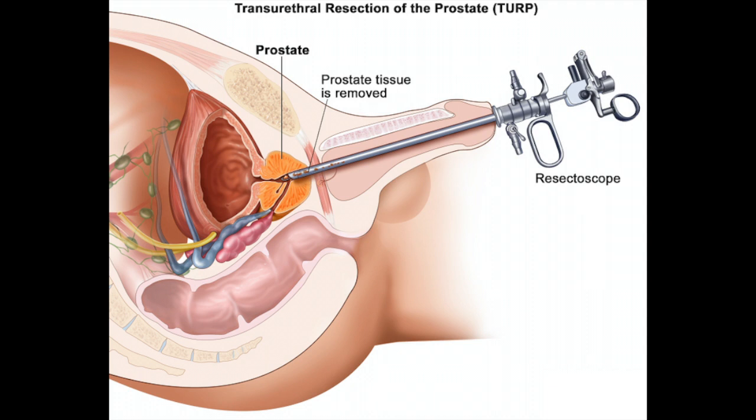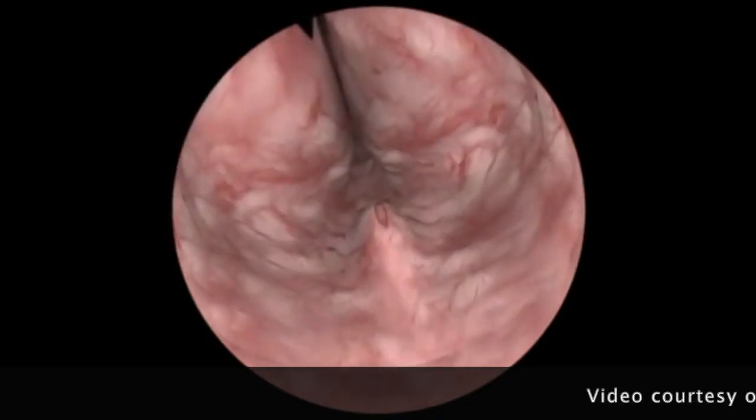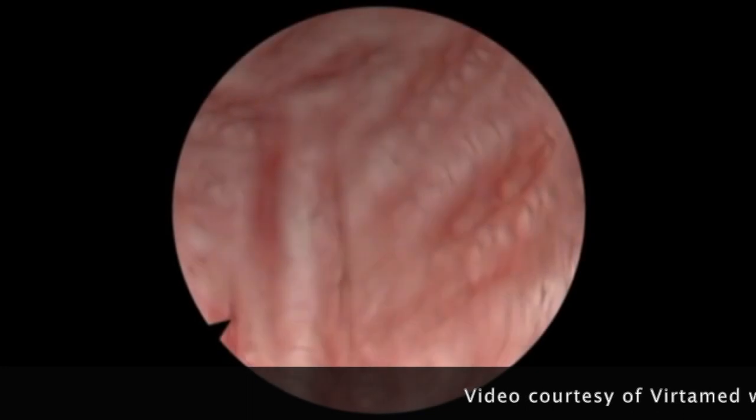An instrument called a resectoscope is passed along the urethra to the prostate. This has a U-shaped loop through which an electric current passes. Here we can see the view as the resectoscope is passed.